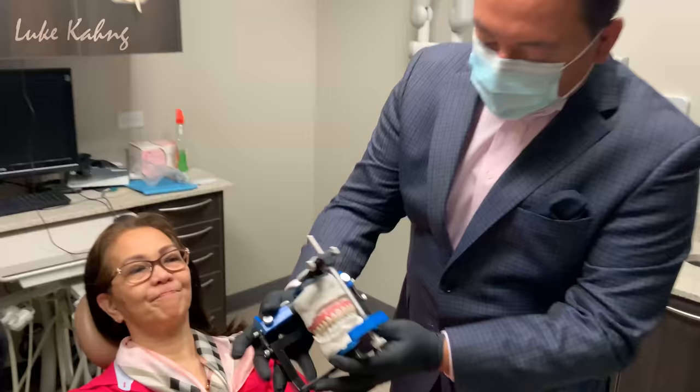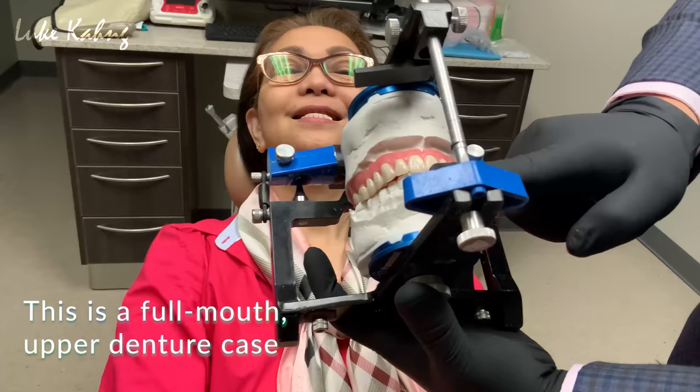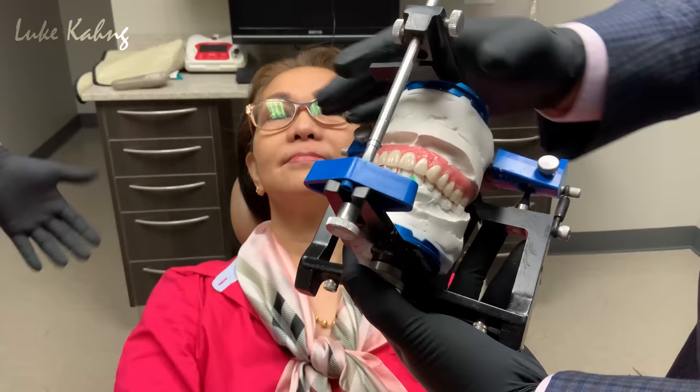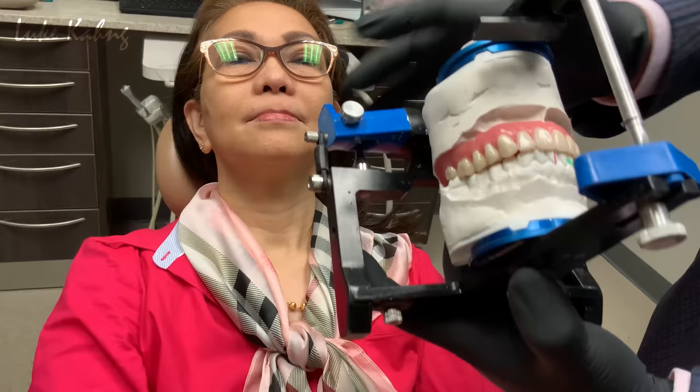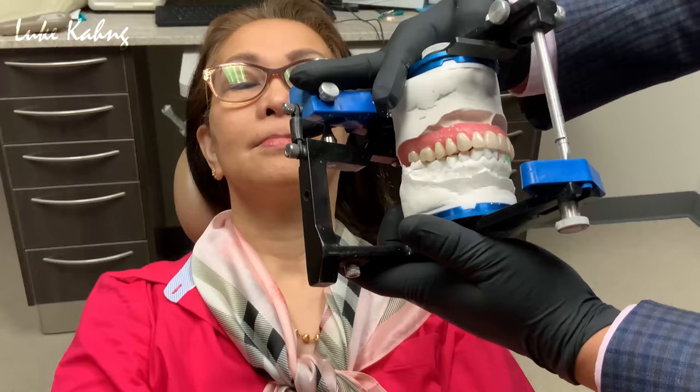Now we actually made some adjustments, right? Because last time we checked her upper try-in and we moved the teeth up, what, 2 millimeters? Right. And then now we have the correct shade, right? The other day, all we did, we just wanted to know the placement, where it was. Correct. We had a bleach shade the other day, but now, yeah, we ordered the Ivoclar teeth, which I don't have. So they sent me the overnight. So we got the A1 base color. So we add together. Beautiful setup, okay?